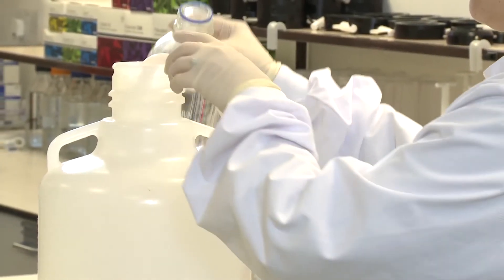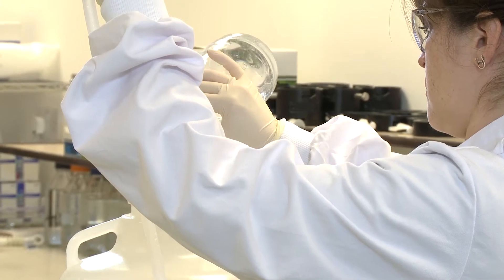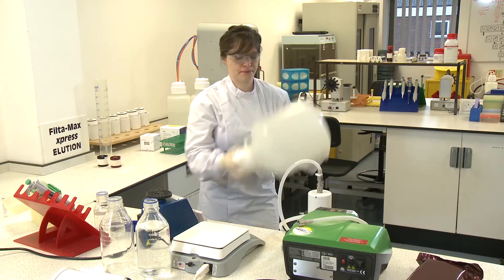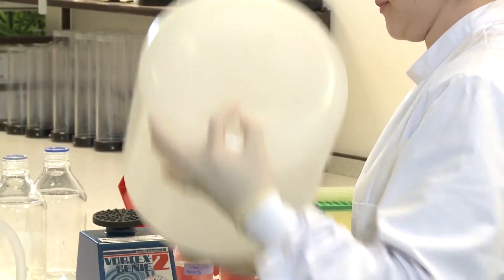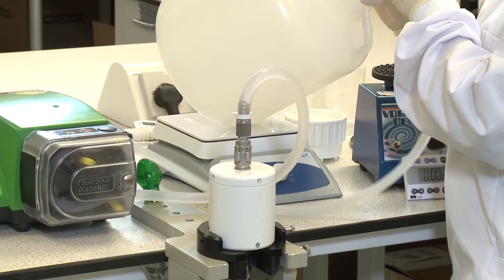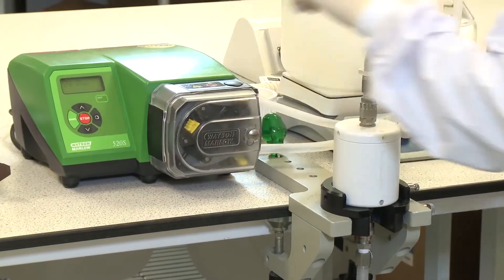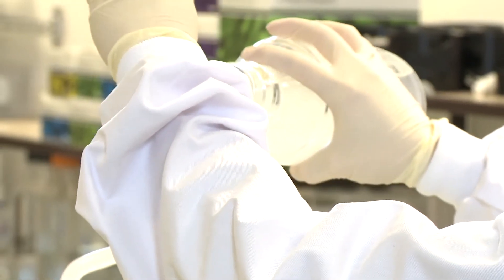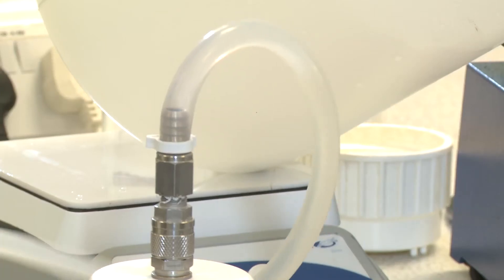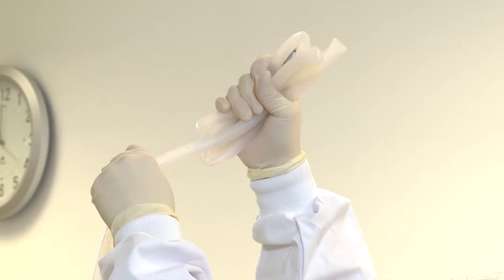To rinse the carboy, add 1 litre of filtered tap water neutralised with 100 microlitres of 10% sodium thiosulphate to the carboy and agitate vigorously. Start the pump to commence filtration of the rinse. Perform a second 1 litre rinse and ensure that any residual liquid is transferred to the filter.